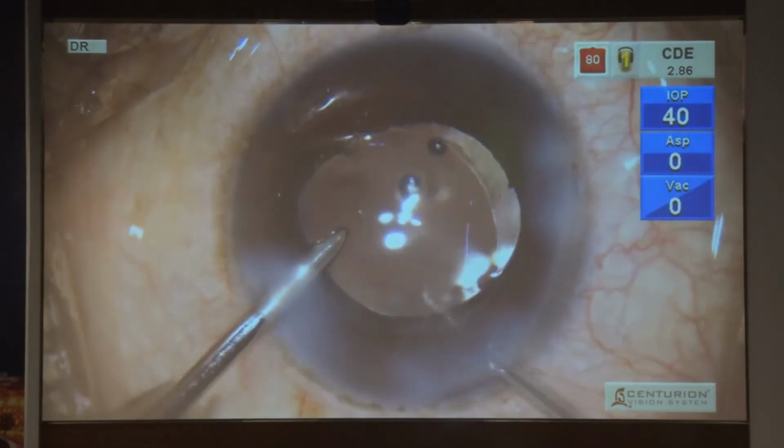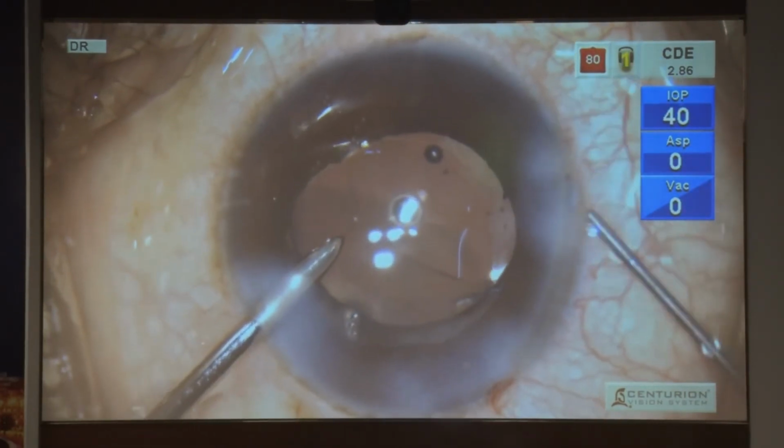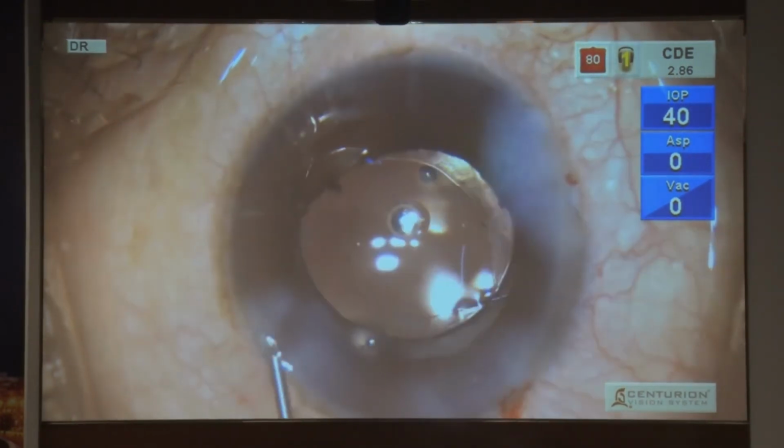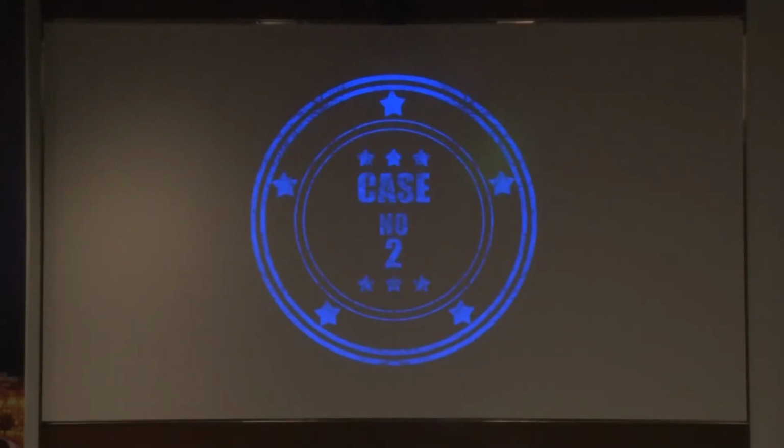And it sits very well. And this is going to be centered perfectly because it has adequate support. Form the chamber at all times. See to it that the chamber does not collapse and become soft.